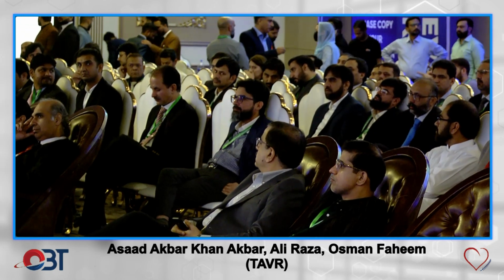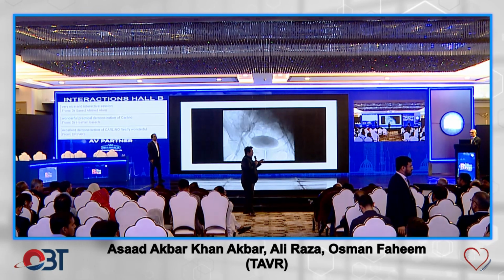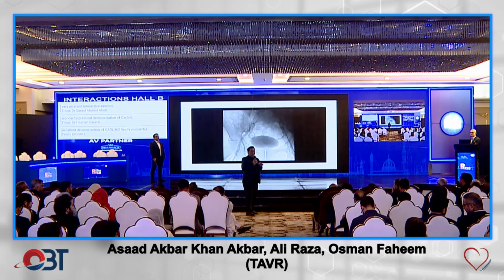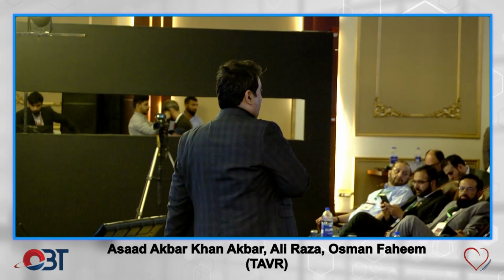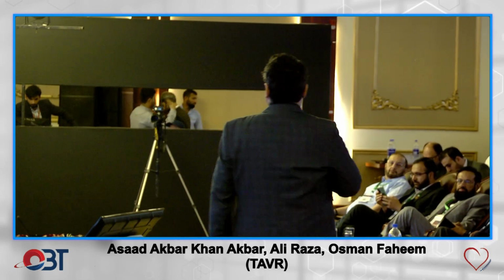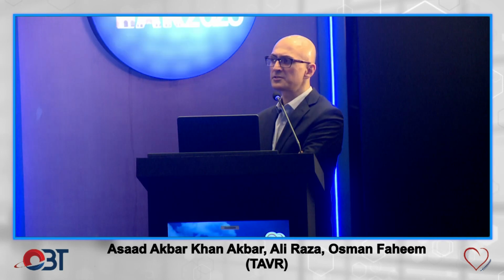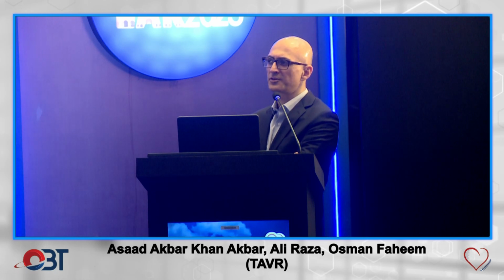So I've got a question. If it's enfolding, what will you guys do? Post-dilate it. Is that correct? Do you guys think post-dilation gets rid of enfolding or not? Most cases, yes. Again, the mechanism matters, but if it's bicuspid and you're really oversized, the enfolding is not going to get that much better.